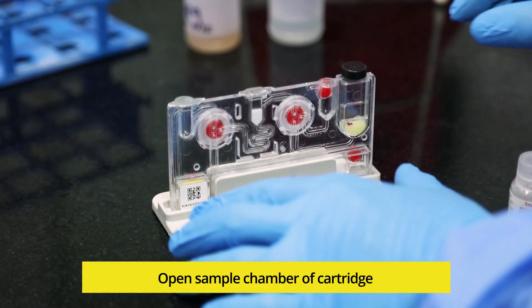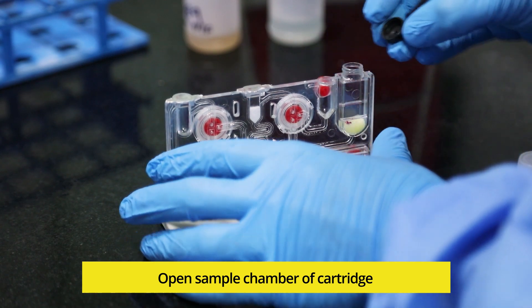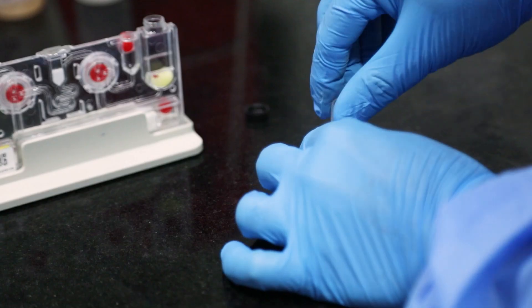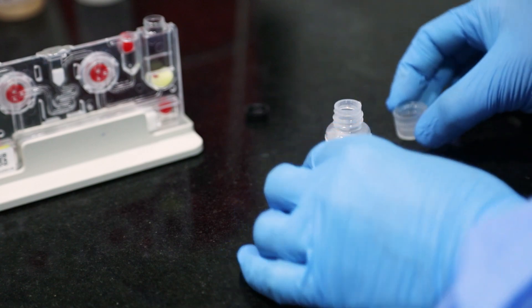Remove the cap of the sample chamber of the cartridge. Now, all the content — approximately 3ml from the Lysis buffer bottle — should be transferred to the sample chamber of the cartridge.